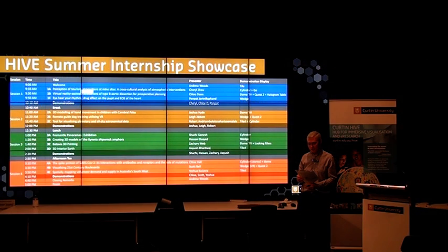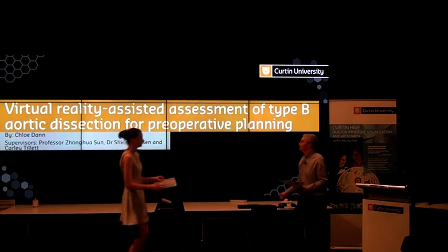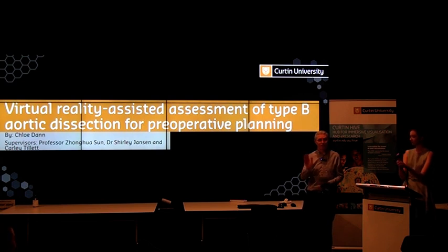Our next presentation is by Chloe Dann. Chloe is currently doing an undergraduate degree in medical radiation science, and her presentation, which I'll just bring up on screen, is investigating virtual reality assisted assessment of type B aortic dissection for preoperative planning. So if ever you need to do one of these sort of procedures, now you'll be appropriately briefed.